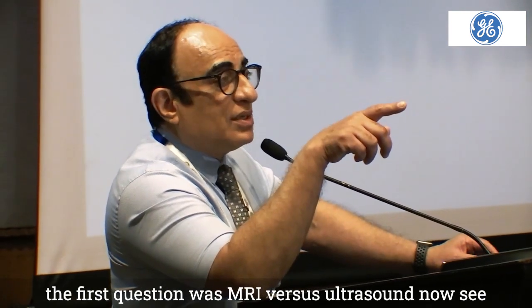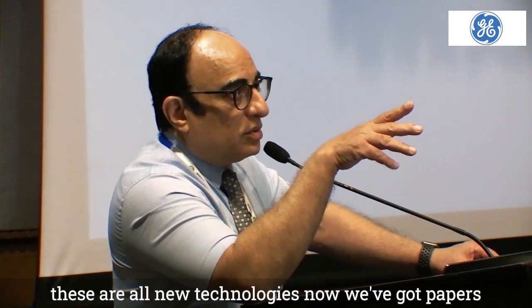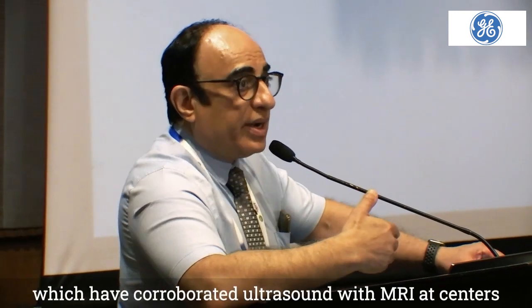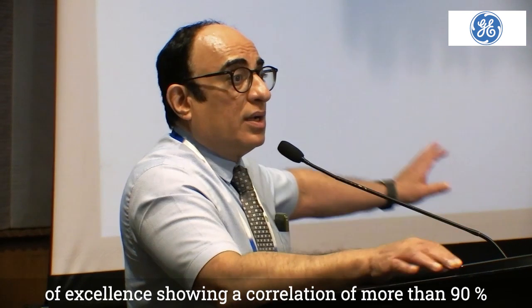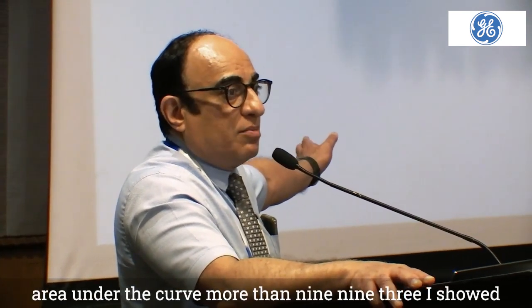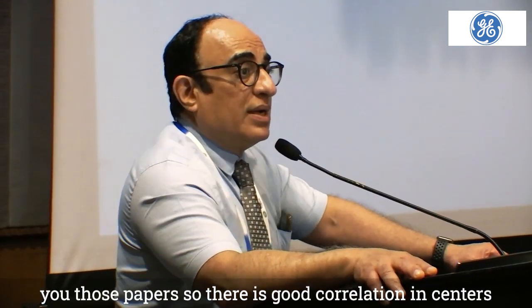The first question was MRI versus ultrasound. Now, see, these are all new technologies. Now, we've got papers which have corroborated ultrasound with MRI at centers of excellence, showing a correlation of more than 90%. Area under the curve more than 0.93. I showed you those papers. So there is good correlation in centers of excellence.